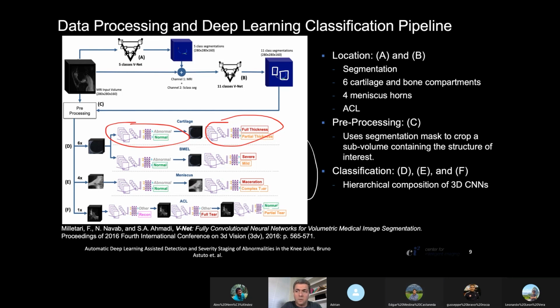I want to say no. If I look at the patella, either it's a normal patella or it has a lesion on it, right? So it cannot have a severe lesion and be a normal patella. I do have multi-class, but I don't have multi-label.